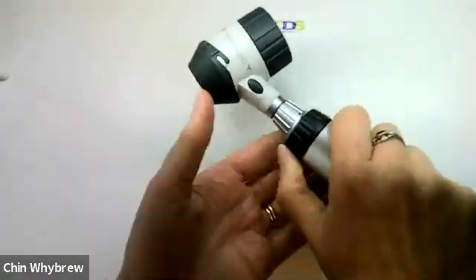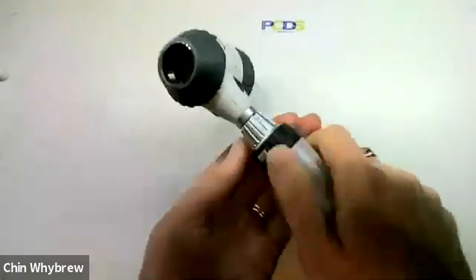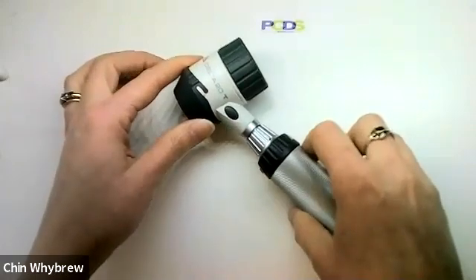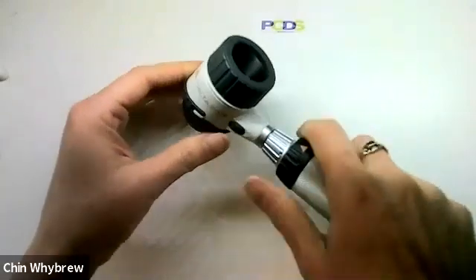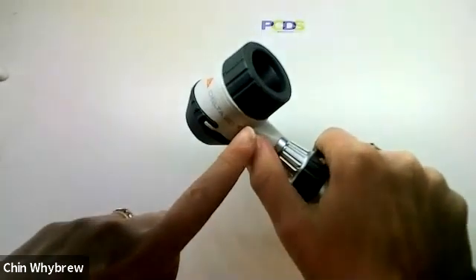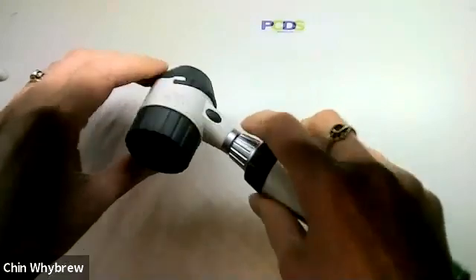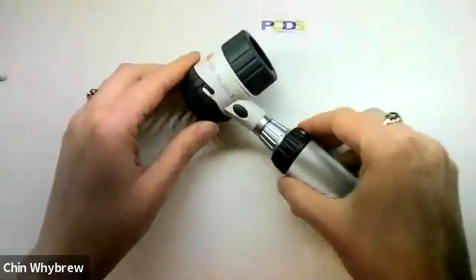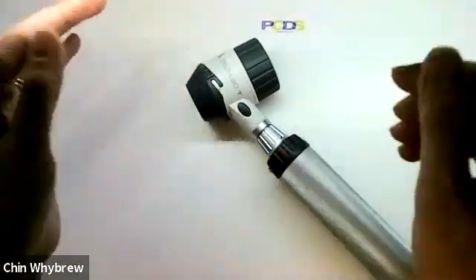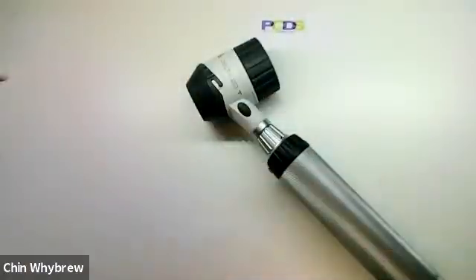The handle turns on in the same way as all the other handles — you press in the button and twist it to turn it on. When it comes on, this button here will switch between polarised and non-polarised modes. There is no indicator light to tell you which is which, so you have to either know or be able to check, and we can teach you how to check that when you come to one of our Dermoscopy for Absolute Beginners courses.